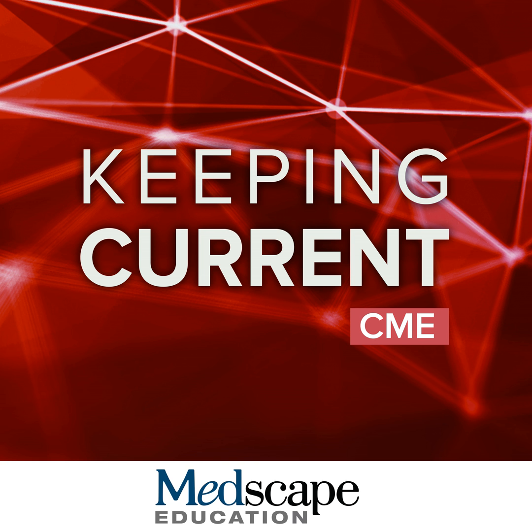But for other acute processes like acute myocarditis, for example, where you may want to bring the patient back and see whether that edema is improving, the T2 map is quantitative. So I just wanted to emphasize that. And for viewers who may not be familiar with mapping, if those aren't integrated into clinical protocols, I want to emphasize that the color scale is arbitrary. Different post-processing vendors will use different color scales, and you can modify it as well. So it's really important that you interpret the color maps, if you're looking at the color scale image rather than the grayscale, in the context of the actual color lookup.